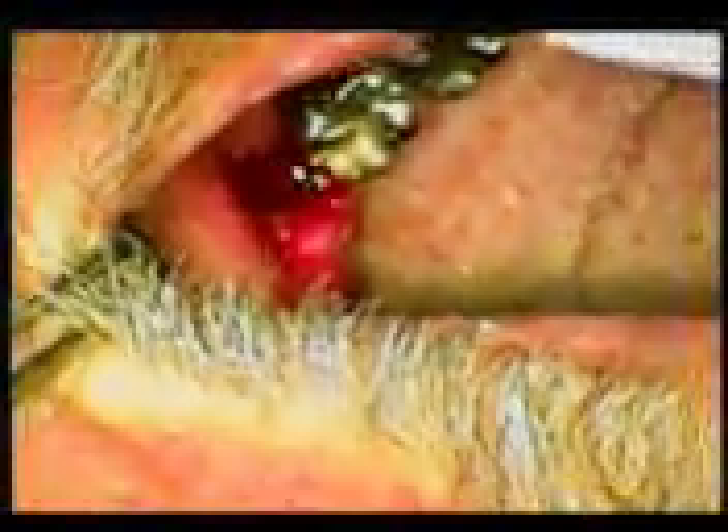He's oozing just a little bit. He's not on any kind of blood thinners other than an aspirin regimen, and you're going to get a little oozing. The differentiation between oozing and bleeding — pressure's your friend in this case. So here we're going with a wet two by two gauze.